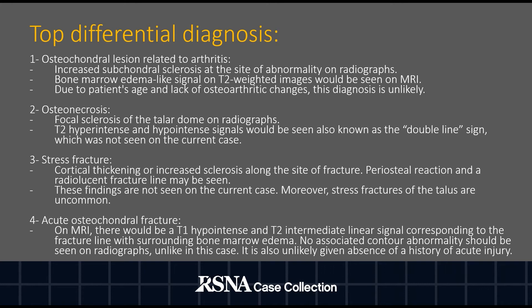For acute osteochondral fracture, on T1-weighted imaging, a hypo-intense line extending to the joint space is seen representing the subchondral fracture line with involvement of the articular cartilage. On T2-weighted imaging, intermediate signal may be seen corresponding to the fracture line with surrounding hyper-intense bone marrow edema. No associated contour abnormalities should be seen on the radiographs, unlike in this case, and this diagnosis is also unlikely given the absence of a history of acute injury.